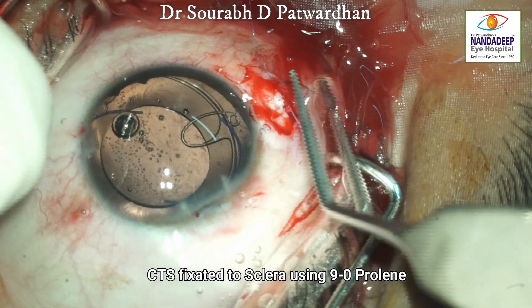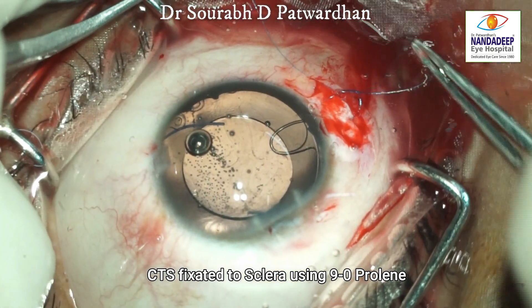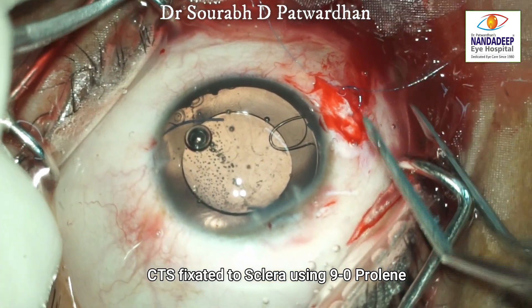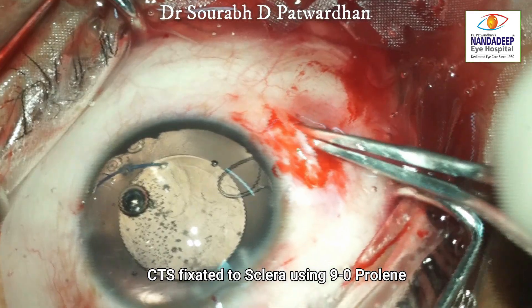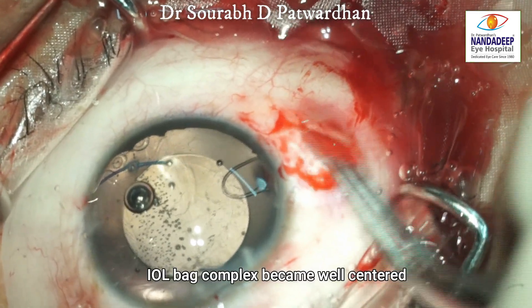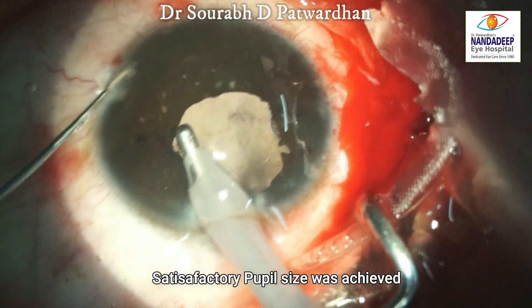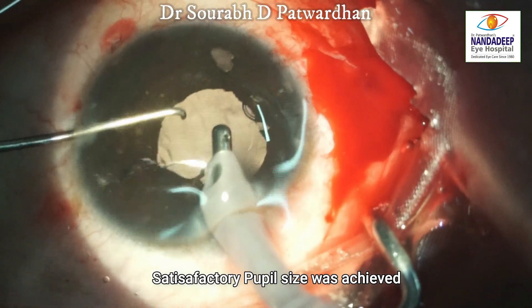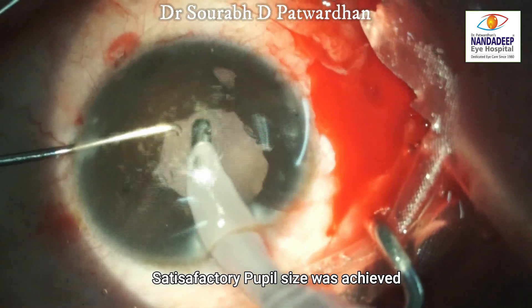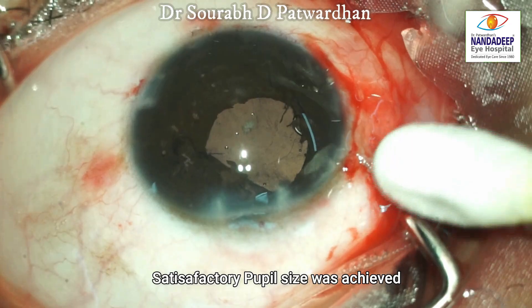Once both the sutures are passed through the sclera under the scleral flap, you have to tie it using 2-1-1-1 configuration, but don't tie it too tight otherwise the bag will get decentered. This is the case after doing pupilloplasty.